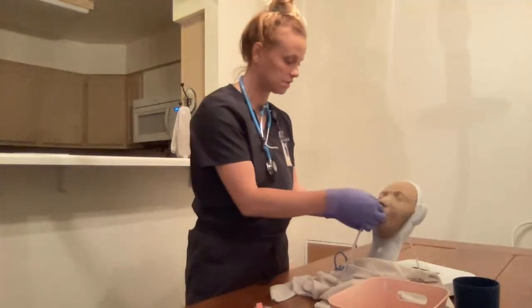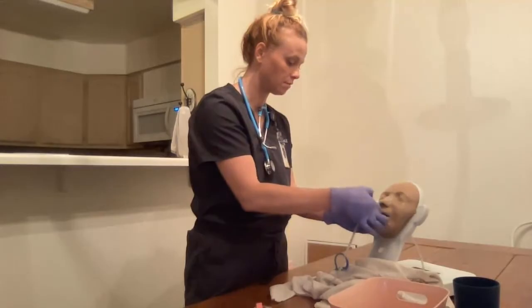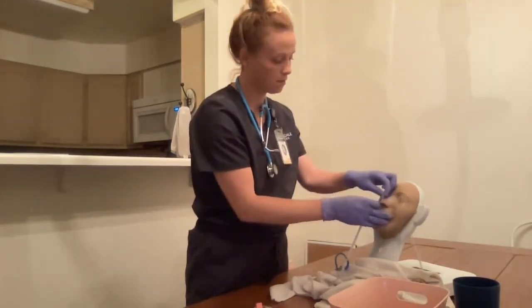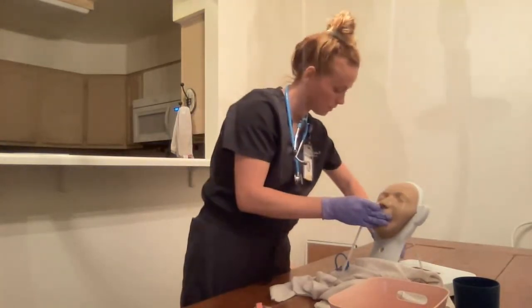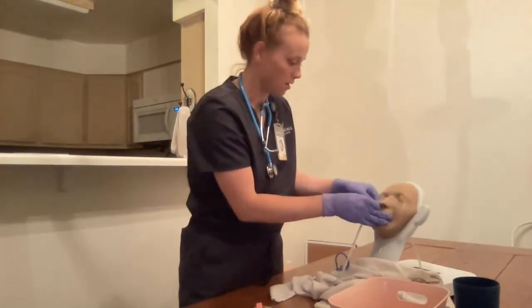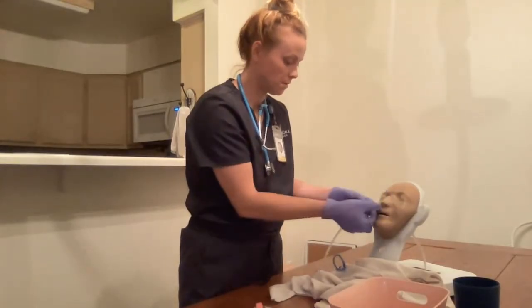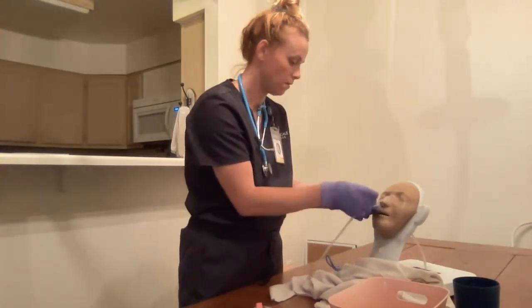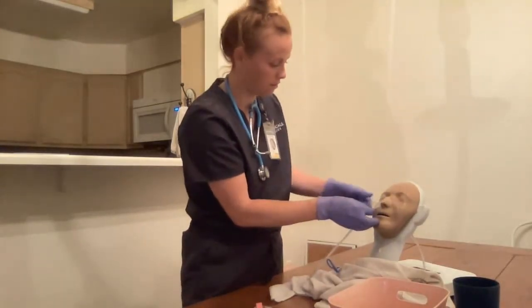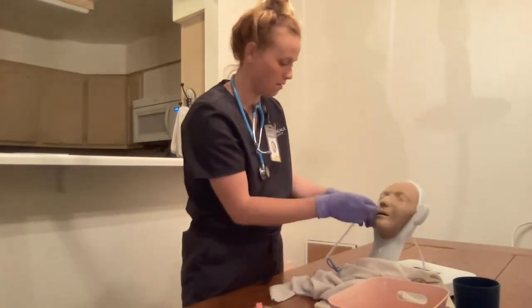Next, I'm going to come over here and apply the permanent tape. Just taking this tape off, Mrs. Smith. I'm going to put the other piece of tape on. All right, I have cut this piece of tape in half, so it looks like two little legs. I'm going to have one wrapping around the tubing going one way, and the other wrapping around going the other way. There we go.